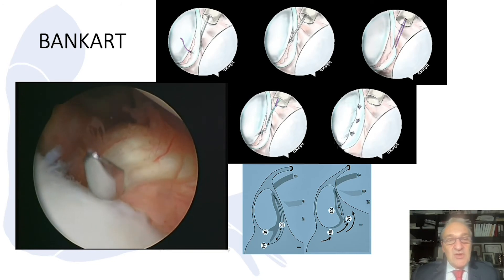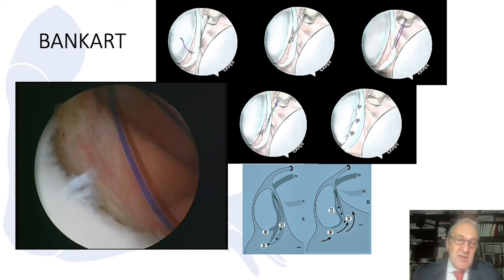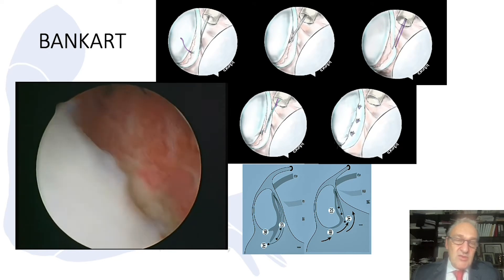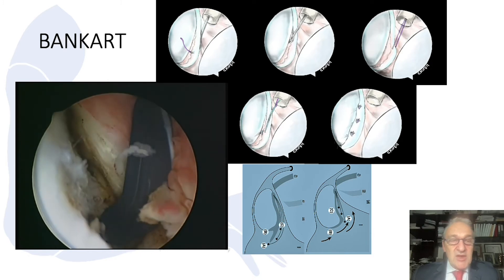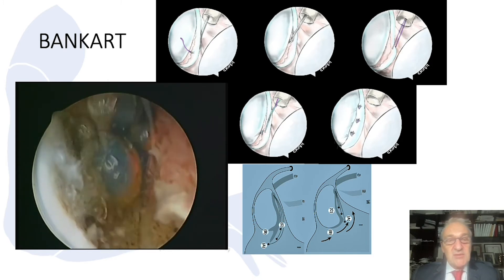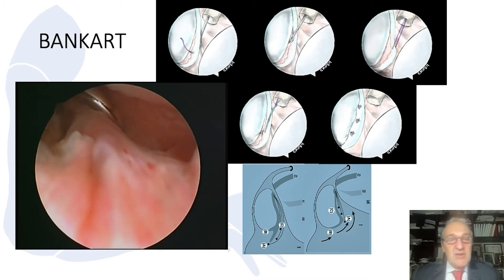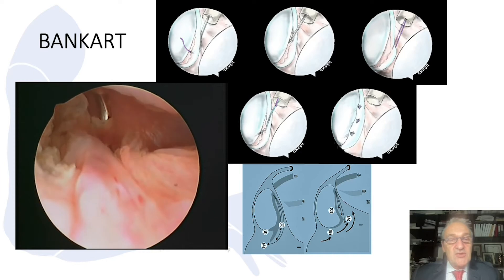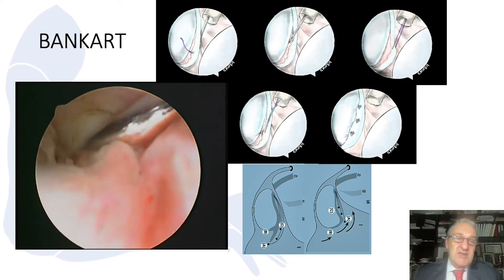If it's an old case, the tissue is elongated and we need some advancement. This point is almost at the 7 o'clock position — we try to shift it to the 5 o'clock position. I use a single portal system. First, I release the ligamentous complex from the bone and then I put a suture. I usually use PDS sutures with suture passers.